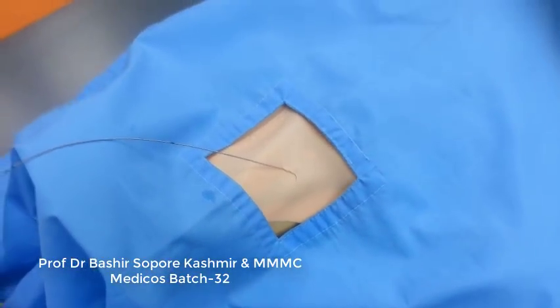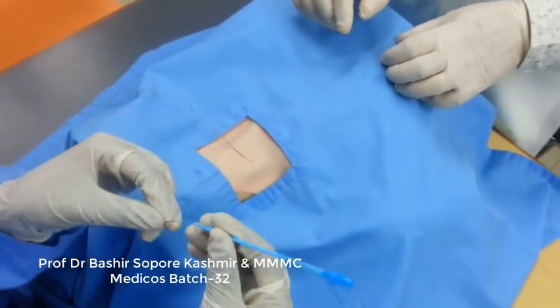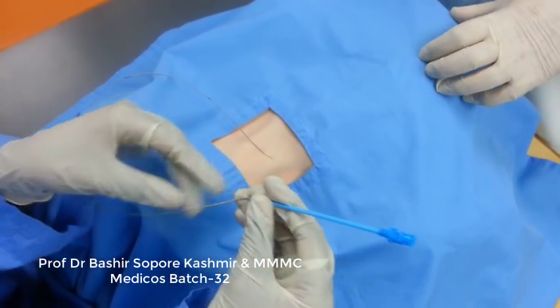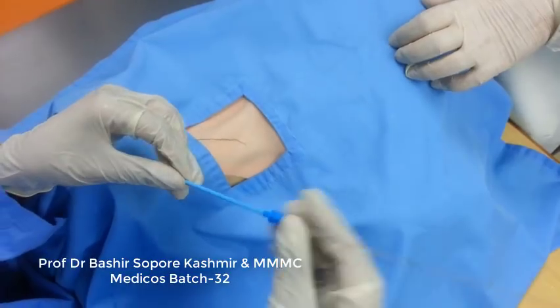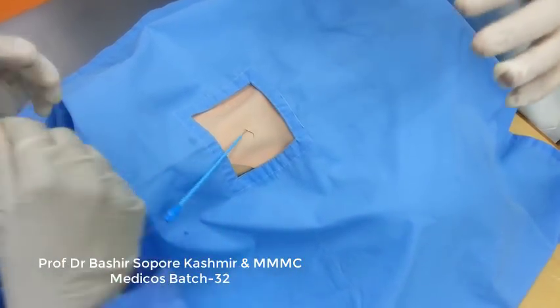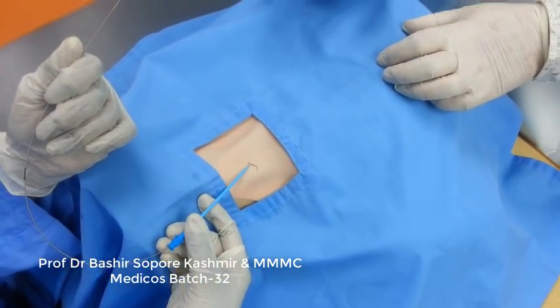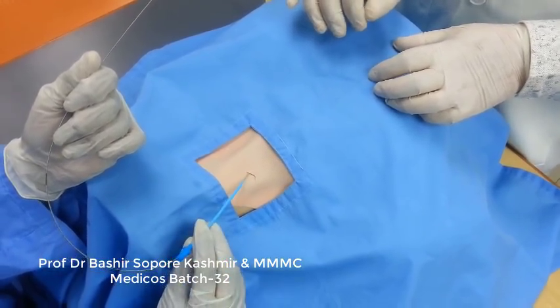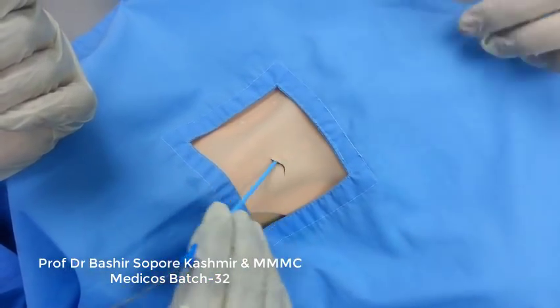So once the nick is given, then we introduce the dilator. How far will you take the dilator? The dilator should go around 1 centimeter. Don't go too deep because it is very big. You see how big it is. If you puncture the carotid artery, it will be hell. It will be fatal, and the patient's life will be in danger. You have to think very much about the depth, because we only want the subcutaneous tissue to be dilated.